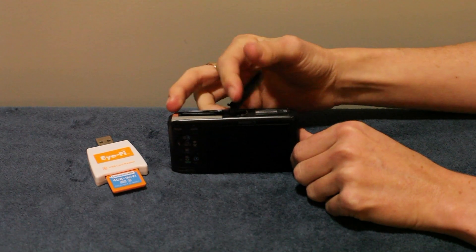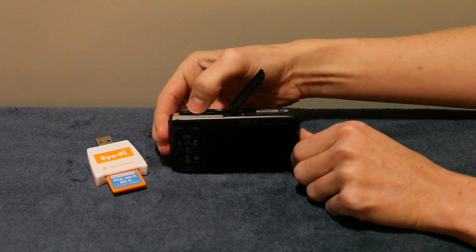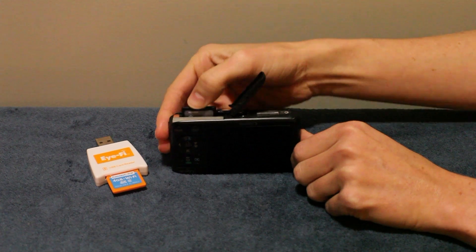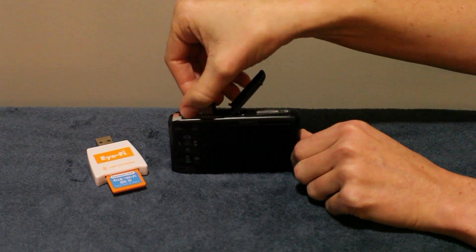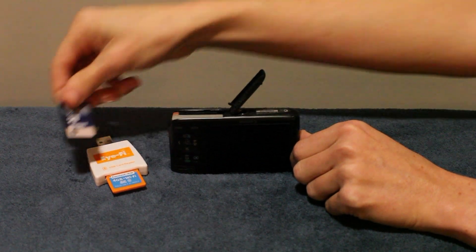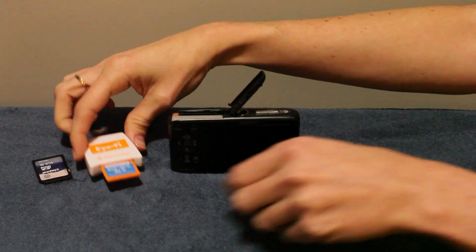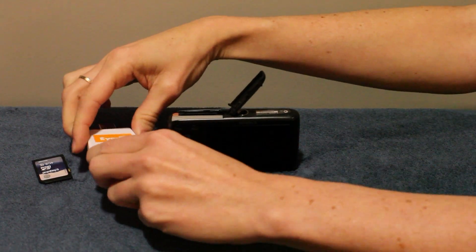After initial setup of the iFi system, simply replace the existing SD card with the iFi card.